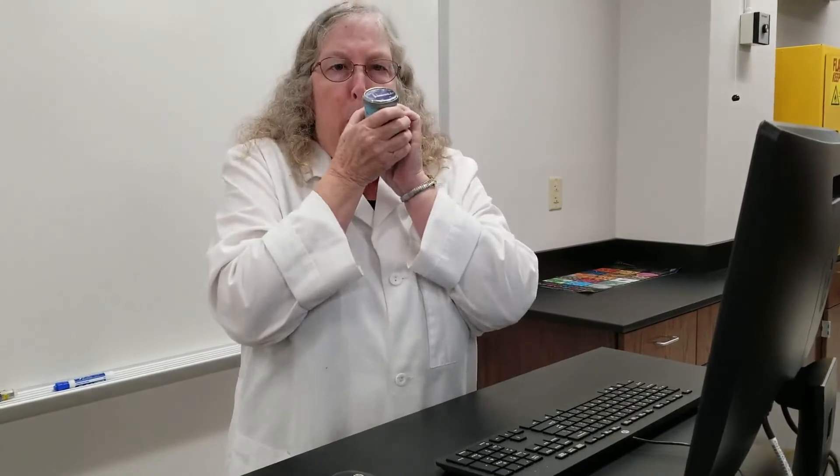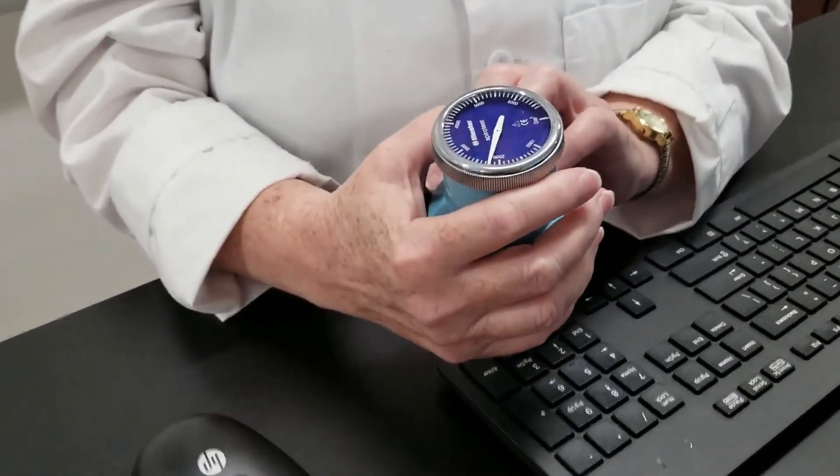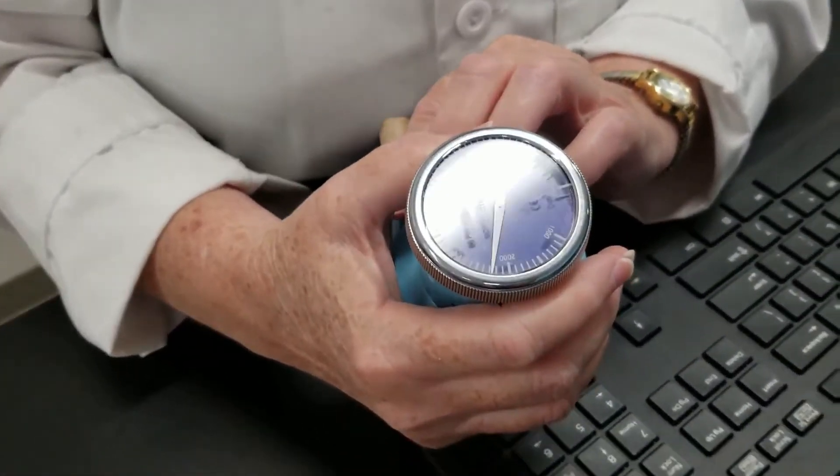These next measurements are going to be the vital capacity — that is the amount of air that I can forcibly exhale after I have done a maximum inhalation. So I'm going to breathe in deeply several times, then take a deep breath and see how much I can blow out as forcibly as possible. The amount is 2,300.